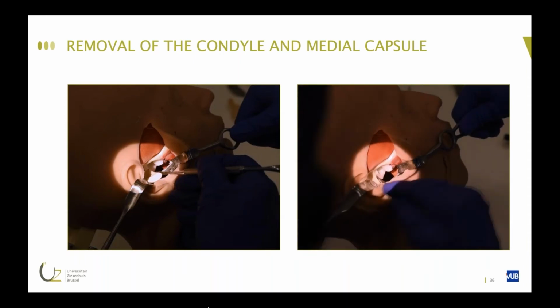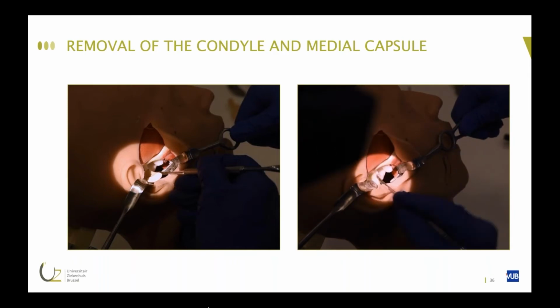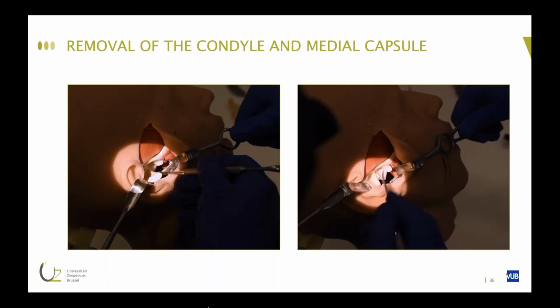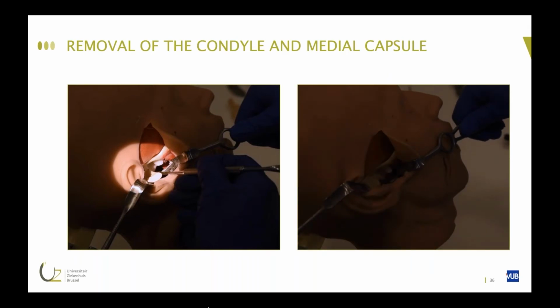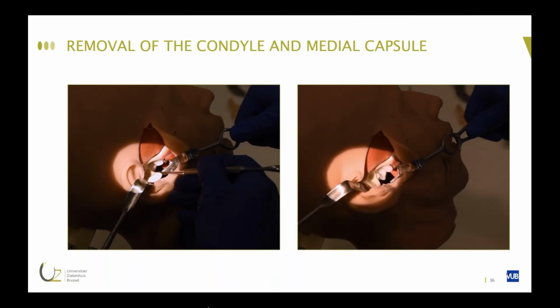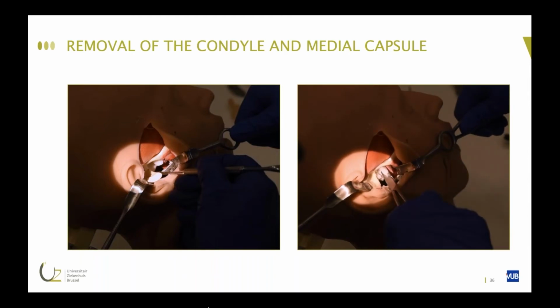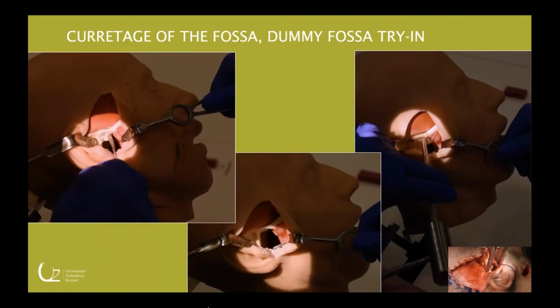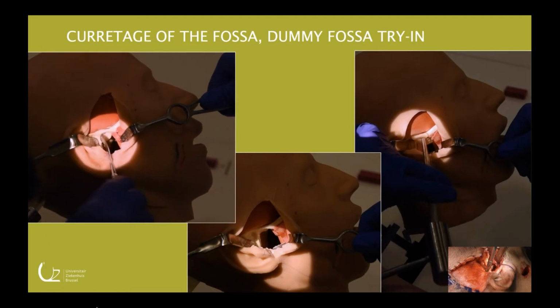Yes, this may be tedious. I use a sharp instrument there because the capsule is made of silicone, I guess. In reality, I recommend you not to use such a sharp instrument, again because of the vicinity of the vessels. There is a lot of adherent fibrous tissue to be cleared from the fossa.